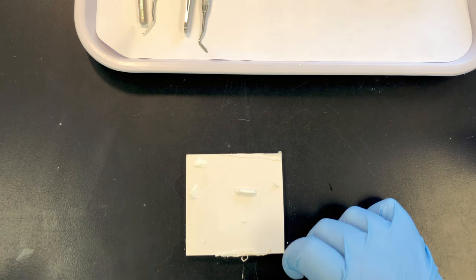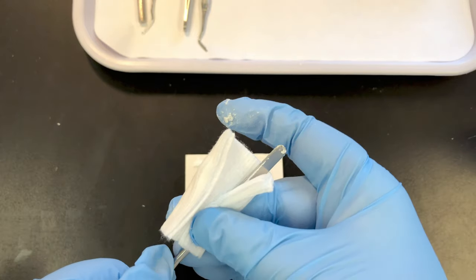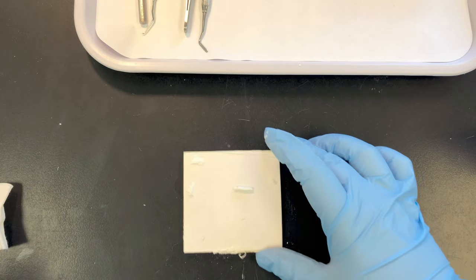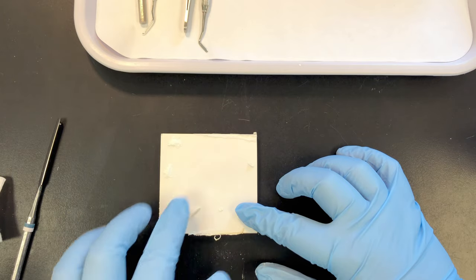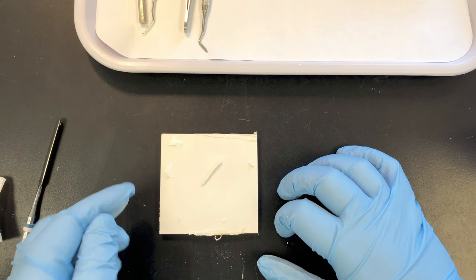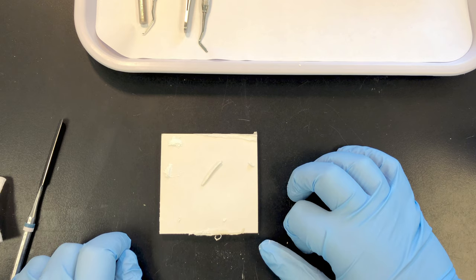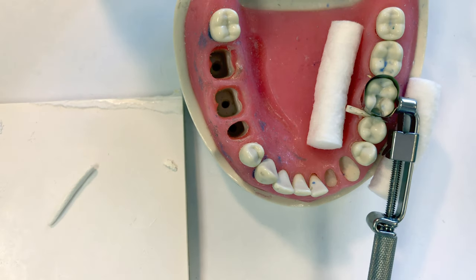I did not use all of my powder — that's okay; mix it to the proper consistency. A lot of different things can change the consistency of your IRM. Wipe off your spatula with some alcohol so it doesn't set. I'm going to keep this in a rope shape. If it sticks to your finger and is really sticky, add a little more powder. It's okay to add more liquid if it's too dry and crumbly. We are placing the IRM on tooth number 19 — it has an MO preparation.